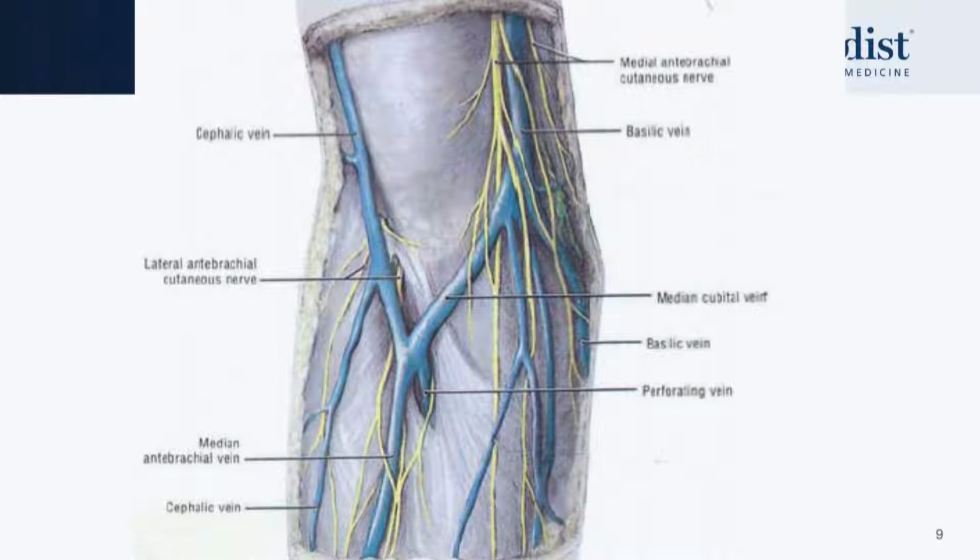And the radiocephalic fistula remains the dominant fistula that should be created for people with dialysis access. And the outflow from the radiocephalic fistula is the thing that really determines the longevity of this. And you can see in the middle of the screen, it's the median antebrachial vein or the forearm cephalic vein that's coming straight up the middle of the forearm. It has three outflows. The upper arm cephalic, which is kind of the most obvious, is not actually the preferred, and that's through the median cephalic to the upper arm cephalic.